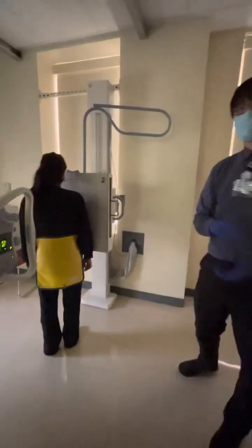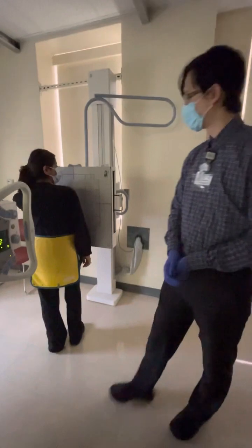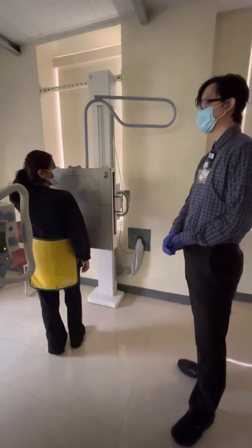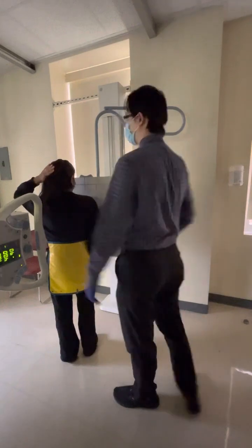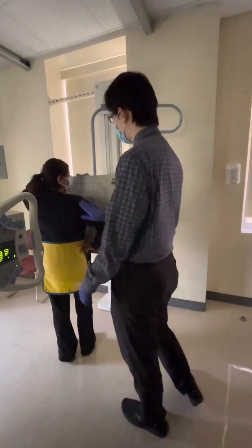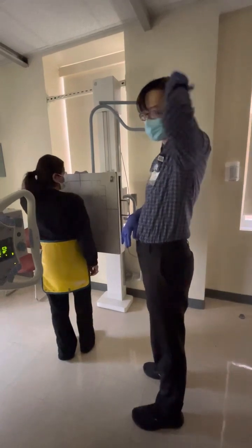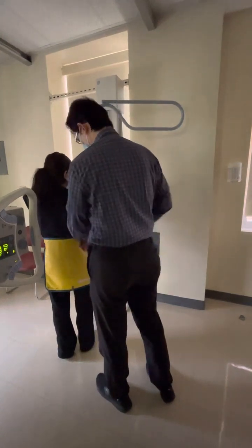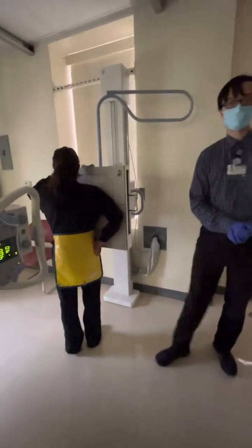Okay. Arm positioning. Anyone still remember how to do arm positioning for an oblique? Right. The star of the show goes up. So in this case, left side is what we're looking at, so left side goes up. Now, because we are PA, we do actually have something special we can do. That's right, instead of putting the left hand on the head, we can just rest it on the IR instead. Okay, right hand will still be on the hips. Good, nice and low, touch that shoulder. There we go. That's our hand positioning.